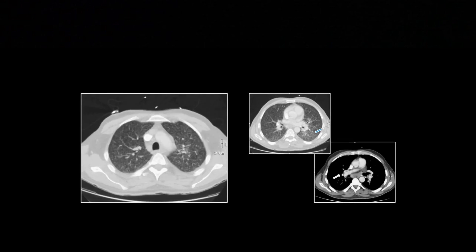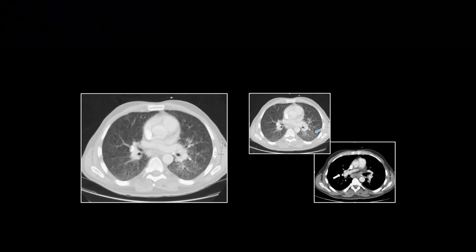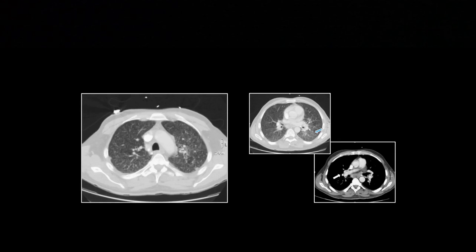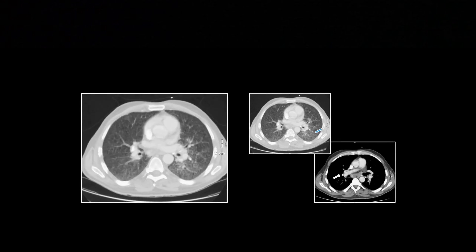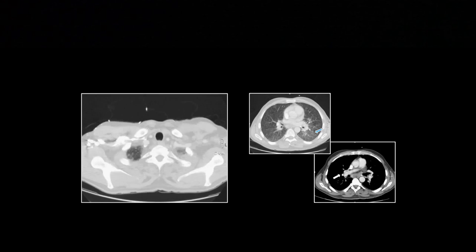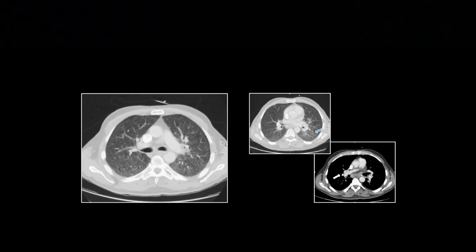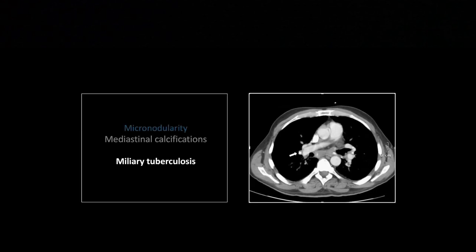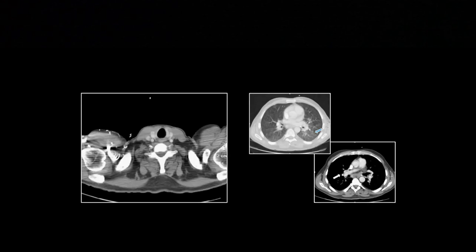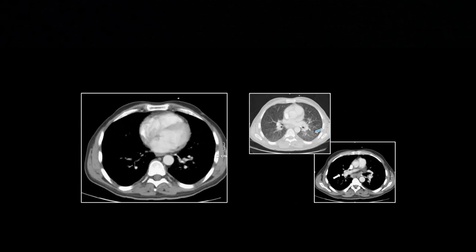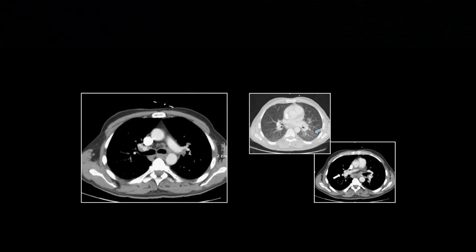This case also has a telltale hilar calcification, which is helpful. Always keep metastatic disease in mind with nodular lung disease — I've seen micronodularity from pulmonary mets; melanoma and thyroid come to mind, and breast can go anywhere and look like anything. But high on your differential here is miliary tuberculosis, with the hilar calcification to support it. They're fairly extensive.